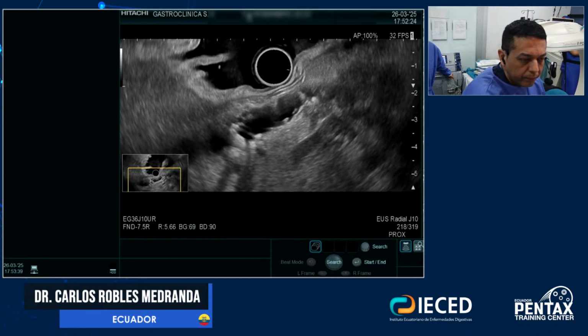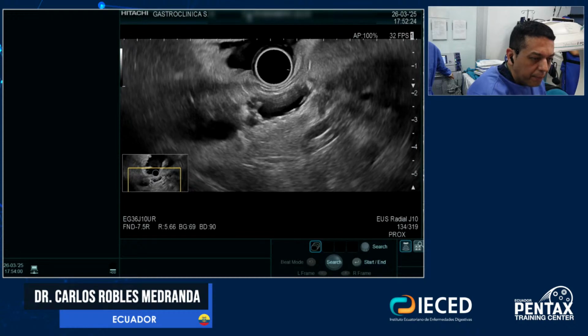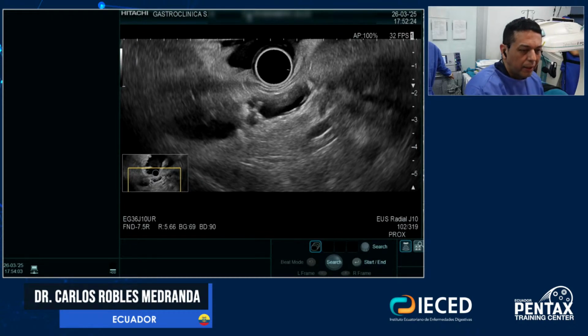You see here, I see some hypoechogenic areas like this one from the wall, and this is isoechogenic. Let's see like that, because this is hyperechogenic, this is isoechogenic, but this area is hypoechogenic. So in this case, to be honest, I believe this is something that my good friend Isaac Reichman also said. This is very important to be evaluated from inside, not just by US.